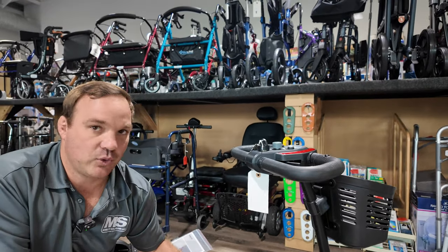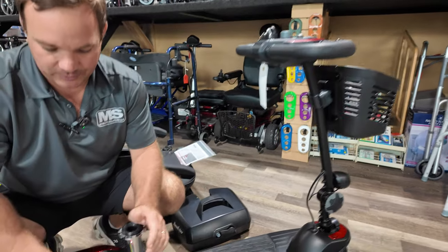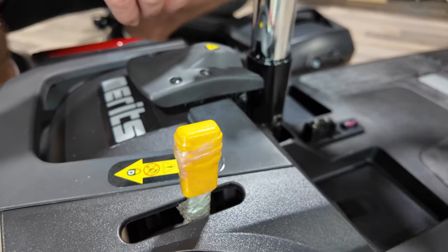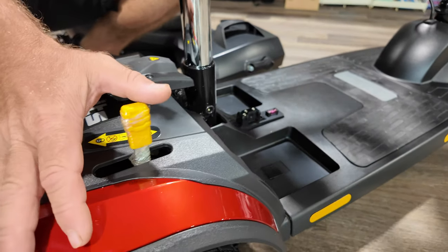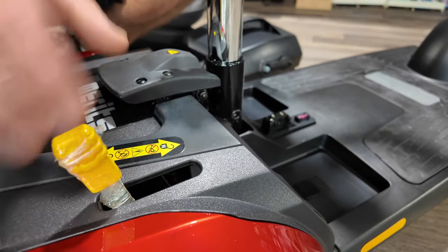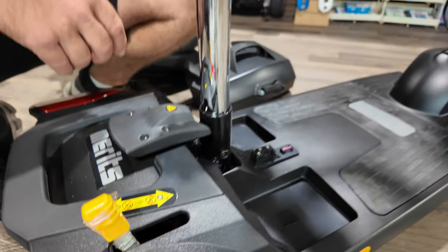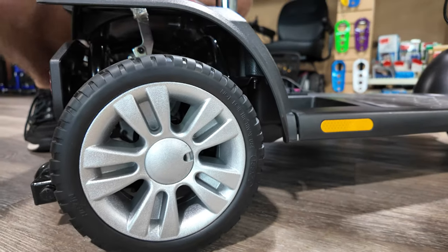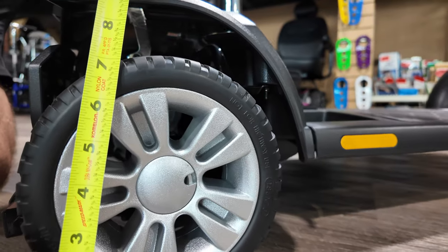This battery pack is about 20-something pounds. This right here is your freewheel — if for some reason you had to push it with the unit turned off, it allows it to roll. This is the most common call we get: something's not working and it usually just needs to be put back into the drive setting. These tires are really nice, though ground clearance is not very high. The tires are about seven inches.